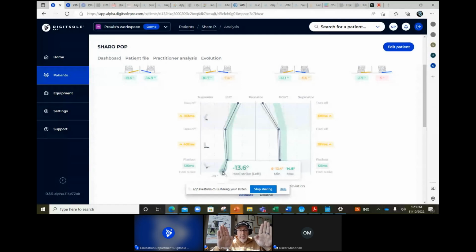And then typically when people go from heel strike into putting their foot flat, they neutralize that, right? So it goes into a more neutral position, not eversion, not inversion, not supination, pronation, but sort of that neutral. Not perfect, I know that, but it does reduce, is the point, from that supination, if you were measuring supination, but definitely the heel inversion, and it goes into a more neutral position, which means that it's going in the direction of eversion. Okay. And so that's what this green corridor is right here. So it looks pretty decent.